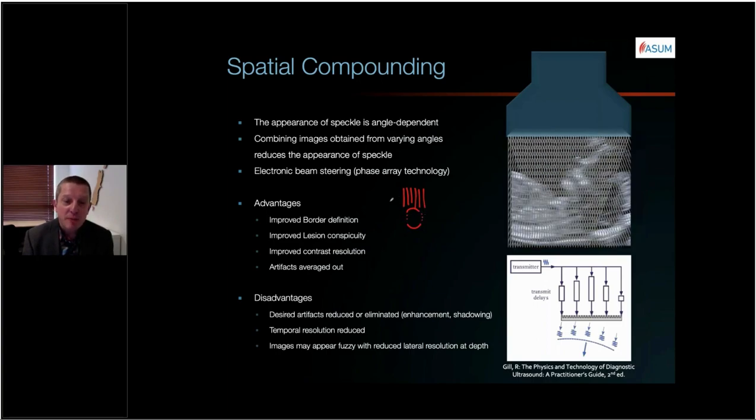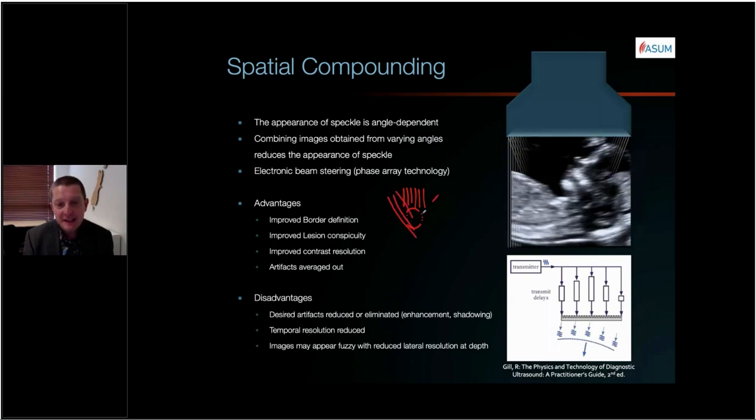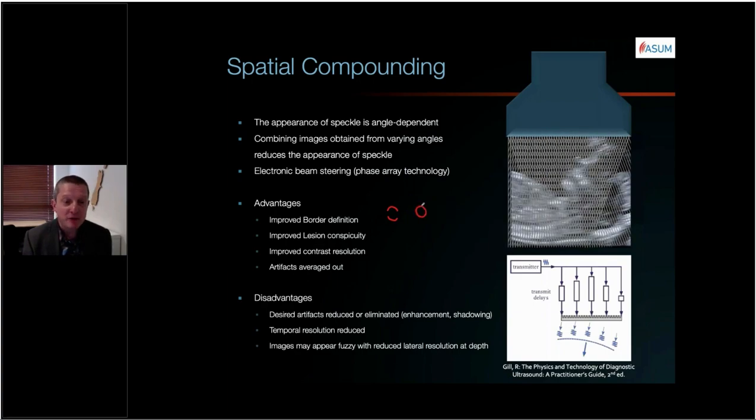With spatial image compounding, some of the beams will be interrogating that part of the cyst at favorable angles, and so the cyst boundary will fill, and instead of seeing cysts as just a shell on top and shell on the bottom, we now have full definition of cysts, various masses, and organ boundaries. Because of this, we also have improved lesion conspicuity. By conspicuity, I mean visibility.